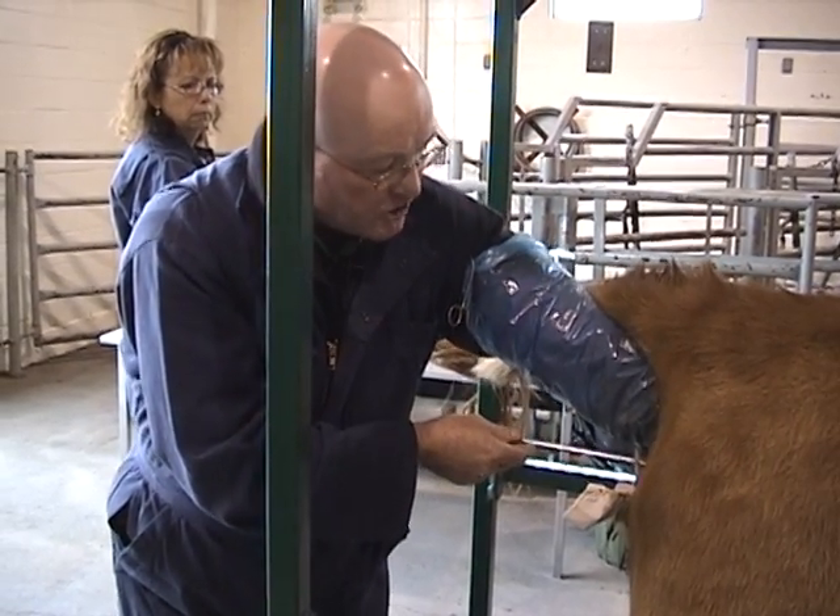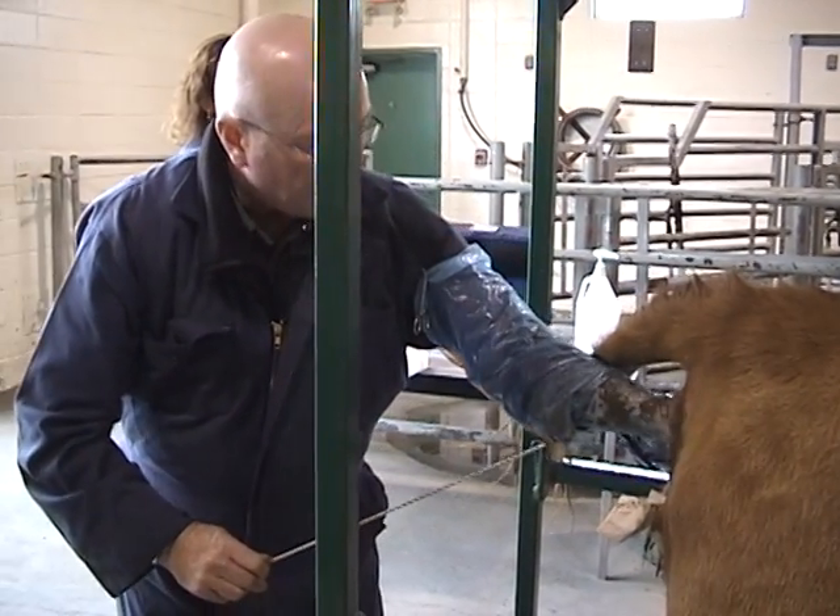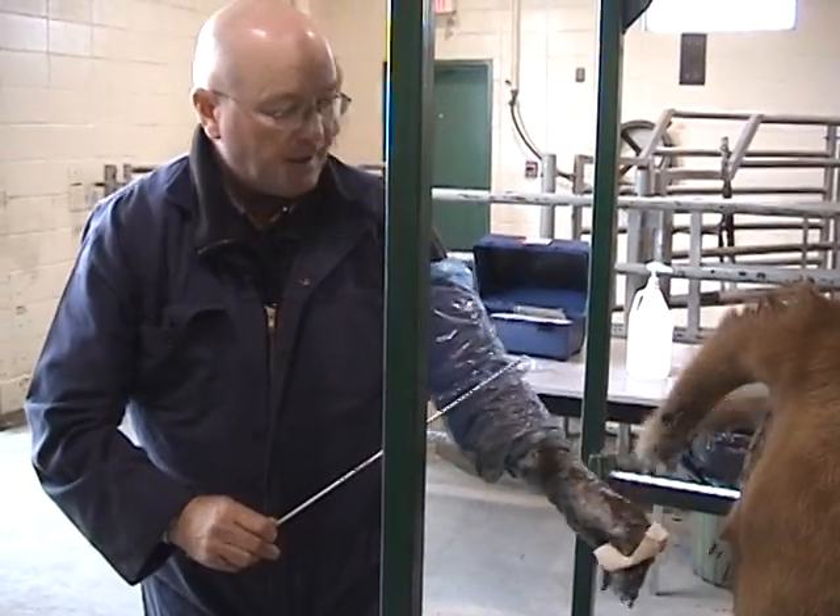Once I'm finished depositing the semen, I'm going to pull the gun back slow and steady and exit the rectum of the cow.